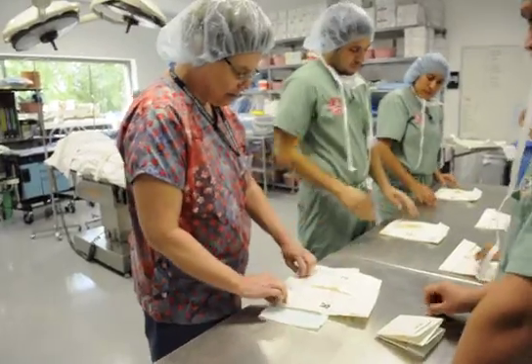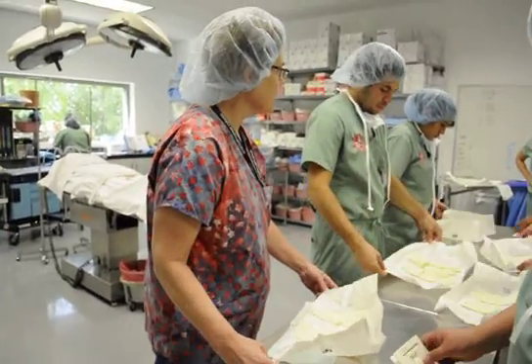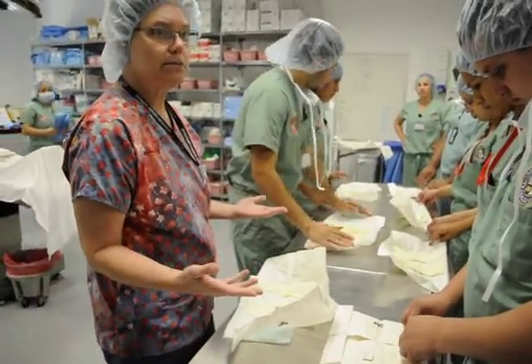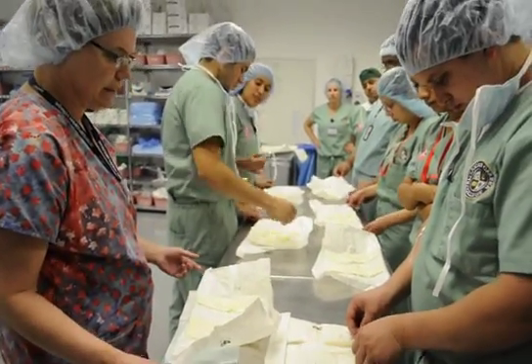So lay it down. When you open it, make sure that it's fully open and doesn't fold back on you, because if this wrapper folds back up on you, it's not going to be sterile. I usually fold the end under just a little bit to make sure that it unfolds.